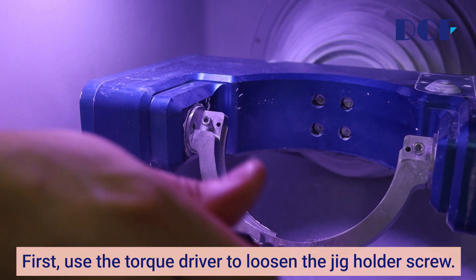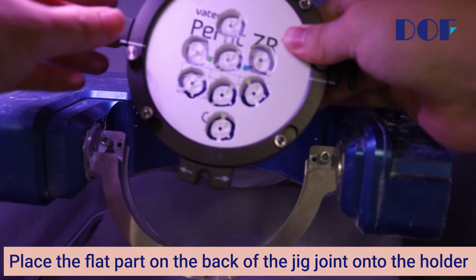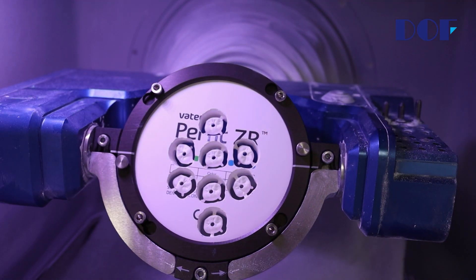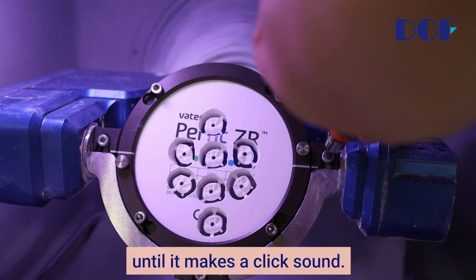First, use the torque driver to loosen the jig holder screw. Place the flat part on the back of the jig joint onto the holder and lower it to mount it. Then, use a torque driver to screw the bolt of the jig holder until it makes a click sound.